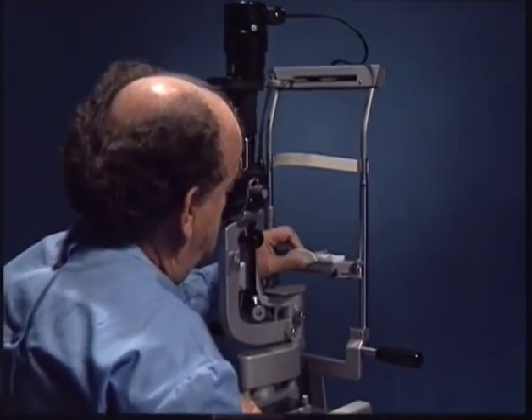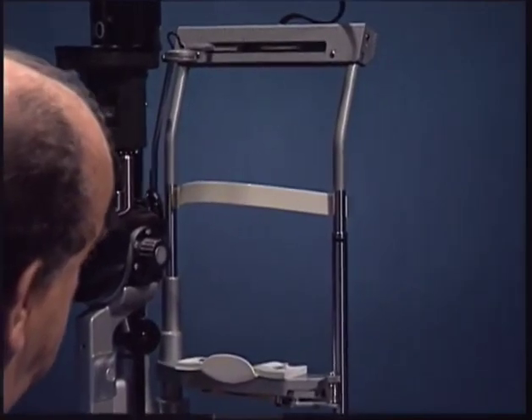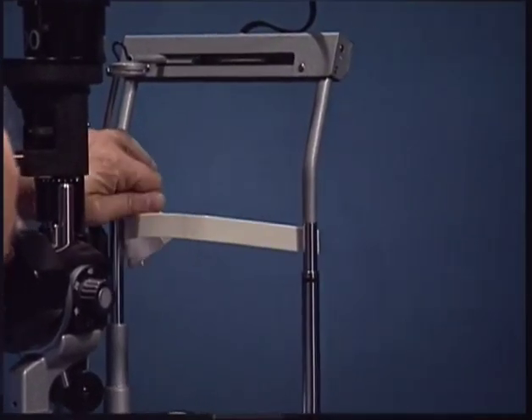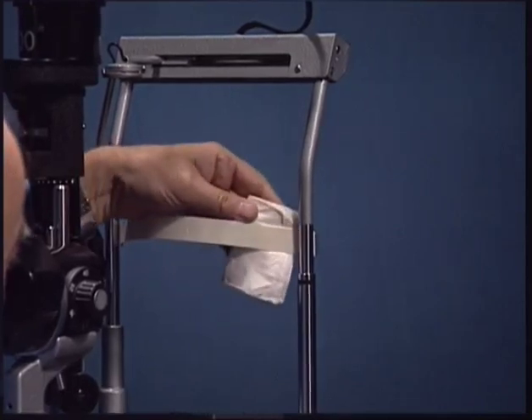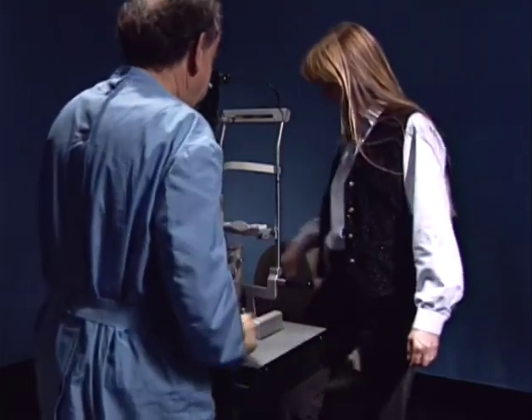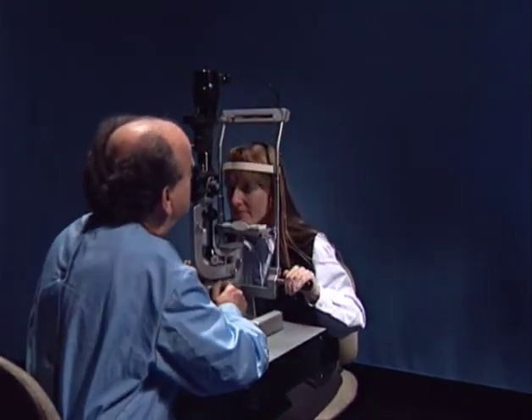At the headrest, the chin rest is equipped with paper covers, which can be discarded after the examination of the patient. For the same purpose, the forehead rest can be wiped with disinfectants if necessary. Before starting the examination, it is important to seat the patient comfortably with forehead and chin leaning against the appropriate supports.